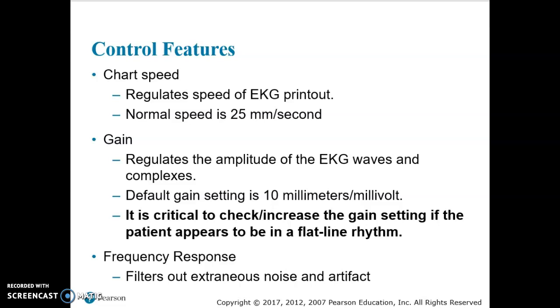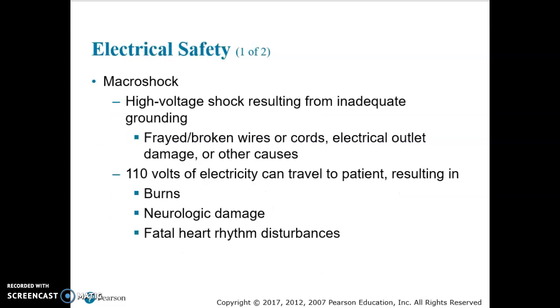The frequency response filters out any extraneous noise and artifacts. It provides for a smoother EKG. Make sure that if you change any of the EKG settings, that is documented on the strip. We want to make sure that we prevent any kind of misinterpretation.